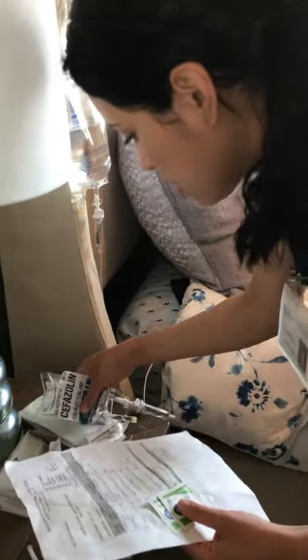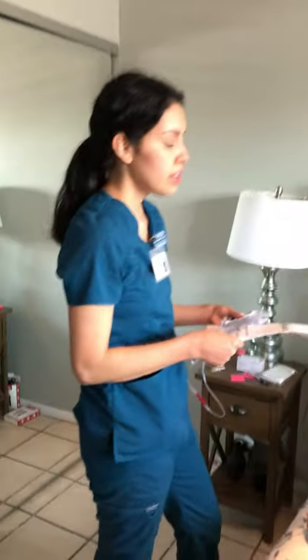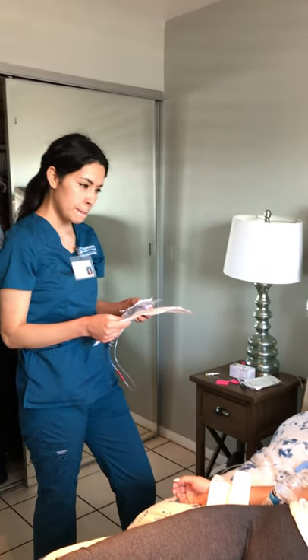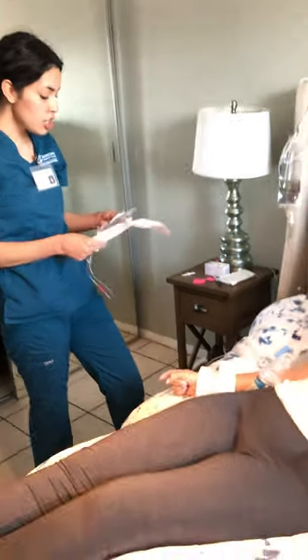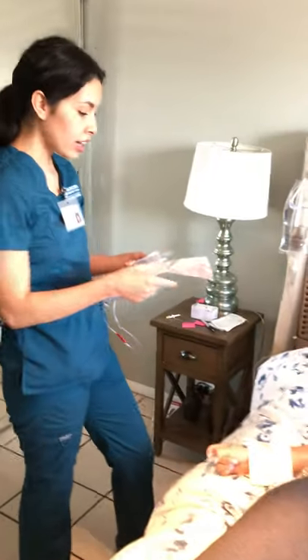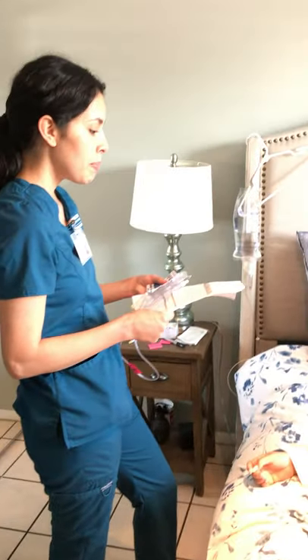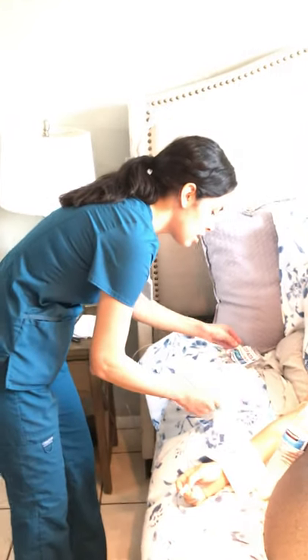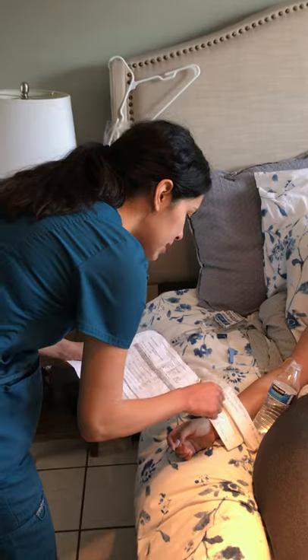I'm grabbing my alcohol wipes and my antibiotics, and now going to my patient's room. Knock knock. Good morning, Ms. Lotta Fallings, I'm Anna, the student nurse who's going to be taking care of you today. How are you? I have an order to hang some antibiotics for you. Can I verify your full name and date of birth?